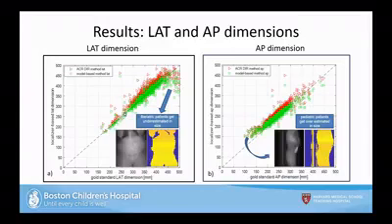You mentioned it's an ACR method, so all the institutions who have the ACR accreditation, do they always use this ACR method? Yeah, just because it's accepted. They recommend that you use their exact method. These are all the studies that I've looked at so far that have tried to do this, have used this extraction method. I was actually talking to someone who was trying to use it for another purpose. He was having some problems with it because, as you know, even we have some issues with it as well. It's just for the extreme cases like this.